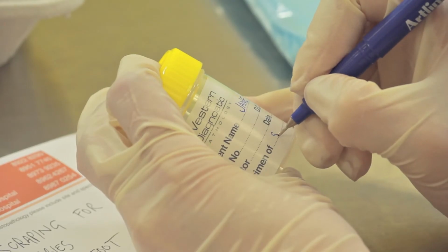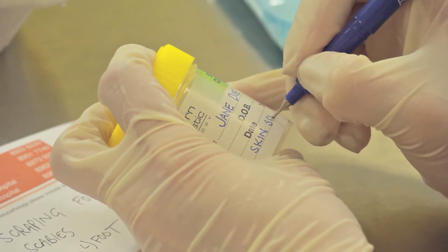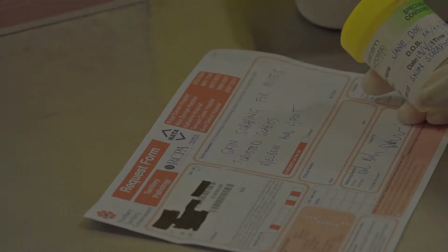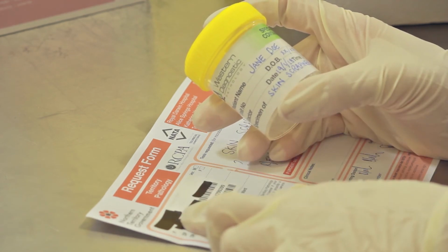To meet the case definition of crusted scabies in the Northern Territory, a skin scraping must return a positive detection of scabies mites. All positive skin scrapings will be reported by the lab to the NT Centre for Disease Control. Ensure the pathology slip requests testing for scabies mites. This is vital, as the lab may only look for fungal elements if not requested.